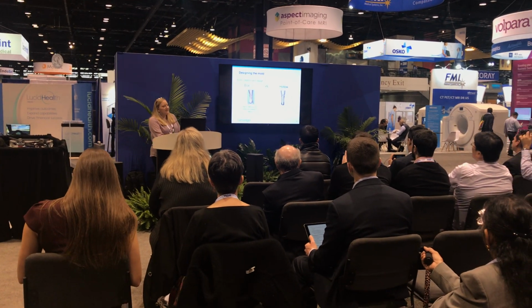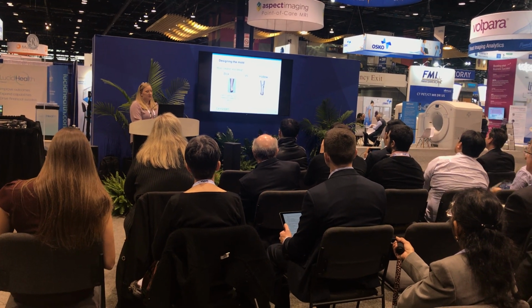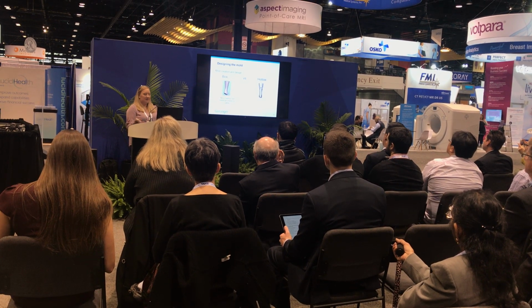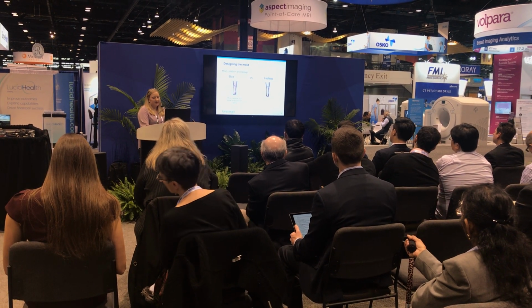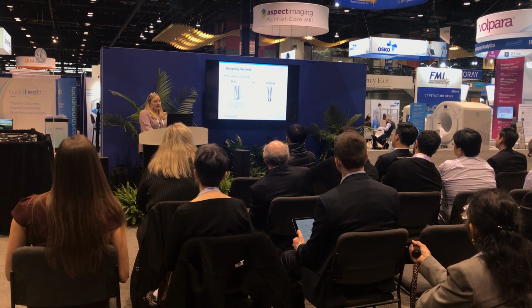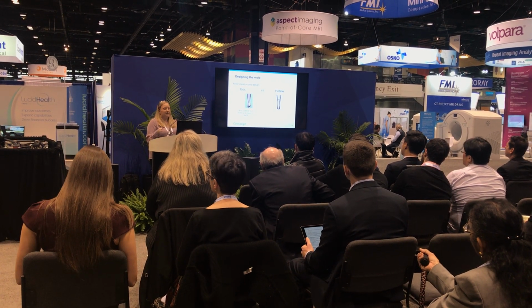There's two different ways that we create the mold at Geisinger. The box: you literally just put a box around your part, subtract the box out, you have the mold, and then you can split it up, label it, whatever you need to do. It does use a lot more material, but it is a lot stabler and easier to clamp and fill.